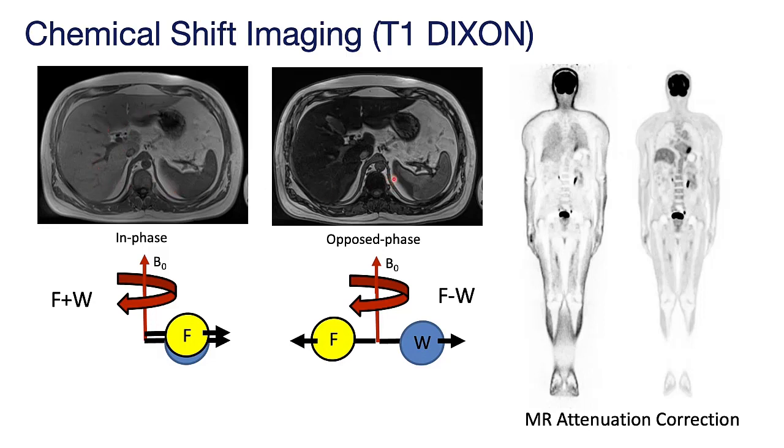abdomen, out of phase image, and there's two things I want to highlight. One is that on the out of phase image, the liver has gone dark, and so has the bone marrow. And this is because this patient is a diabetic with fatty liver, and there are approximately equal amounts of fat and water in the liver. And similarly in the bone marrow, as a young patient whose bone marrow has not developed the predominantly fatty composition of older people, and so there's significant dropout in the bone marrow.